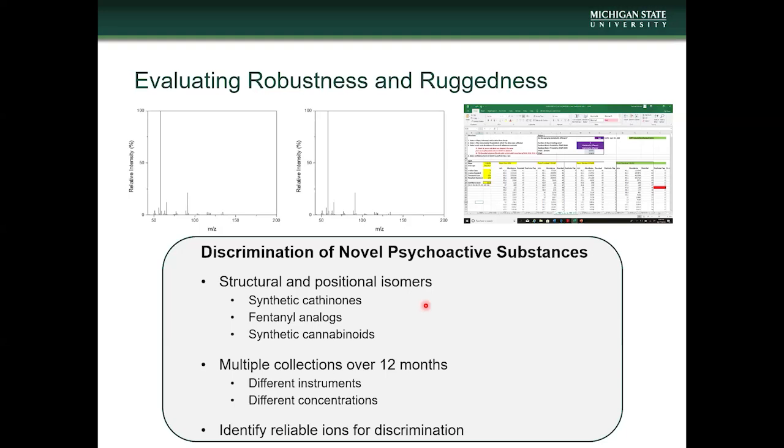And this document is called GCMS Analysis Considerations. It's an Excel spreadsheet that basically highlights groups of compounds for which it's known they're difficult to distinguish based on their EI mass spectra. So it's a really nice document, and for many of these sets of compounds, it gives some indication of ions that might be sufficiently different to allow discrimination of the compounds.